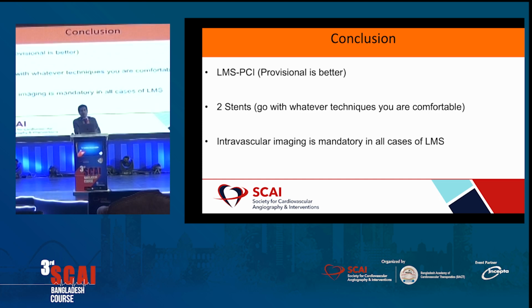The imaging helped in optimization of the stents and also the diagnosis, and also in the last case where there was a calcium nodule, we had to keep repeating the imaging to find out what was the actual cause. And even with the calcium modification with IVL, it kept recoiling and we had to use another stent. Thank you.